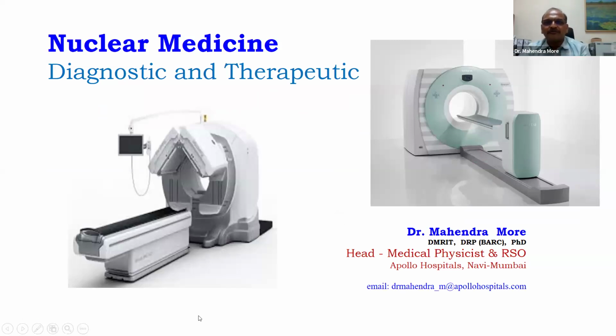So good afternoon again. Today's topic is nuclear medicine and its diagnostic and therapeutic features. Nowadays, along with radiotherapy, nuclear medicine is also part of it, where the PET CT is installed and the same PET CT is being used as a CT simulator. Most of the centers have these features nowadays. So we are using a PET CT as a CT simulator as well.